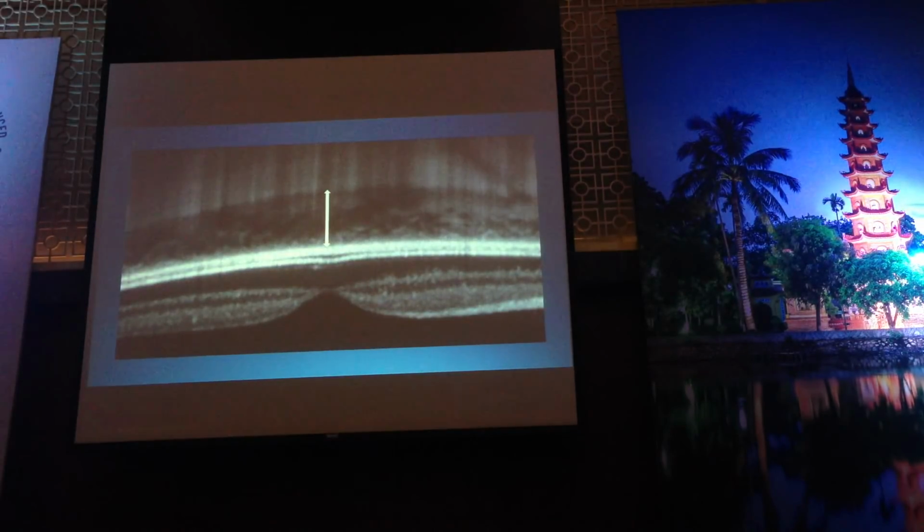This is what we got, the inverted mirror image. When you move the probe of the OCT, which shines the light into the patient's eye, closer to the patient, you can perform this with the machine. The machine adjusts itself when you select the enhanced depth mode, and you're going to get this. When you get this, it means the reference plane is right here at the choroid. So you're going to visualize the choroid quite nicely, a clearer image.